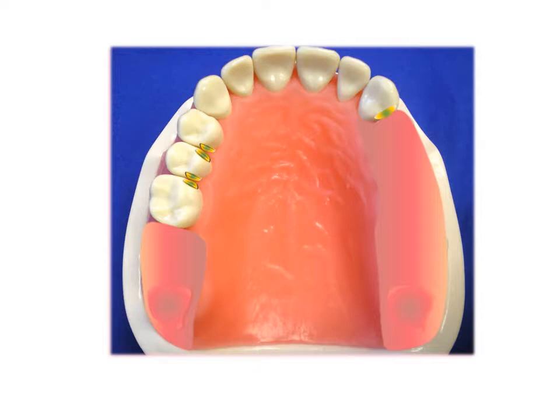We'll look at our carefully mounted and verified casts to examine for occlusion. We very much prefer to avoid areas of habitual contact. The patient does not appear to have a retruded mandibular position that varies from her habitual closure, or MIP. What's next, Dr. Goone? Let's design the partial, starting with guide plane placement.